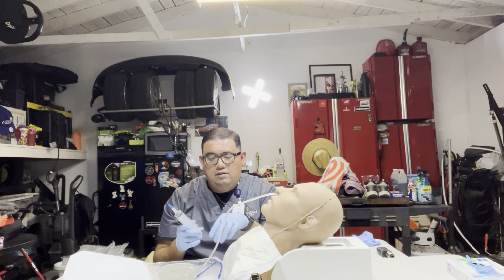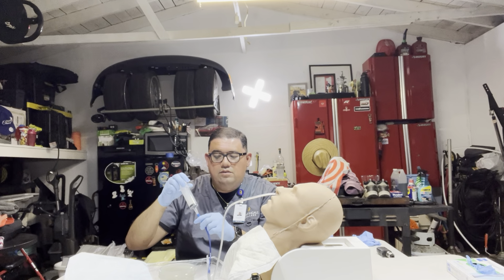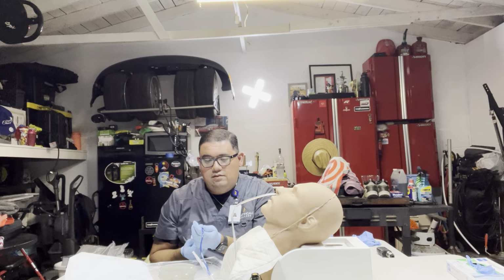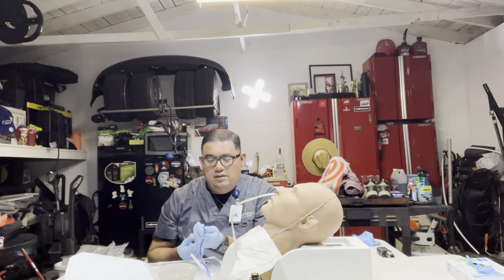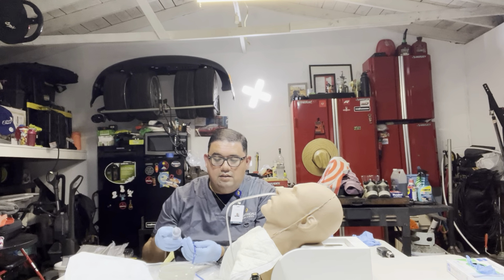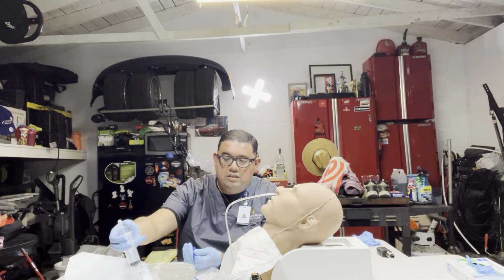Then I'll attach this into the tube to extract some gastric contents. Okay, we got some gastric contents. Go ahead and take this out and place it into the specimen cup.